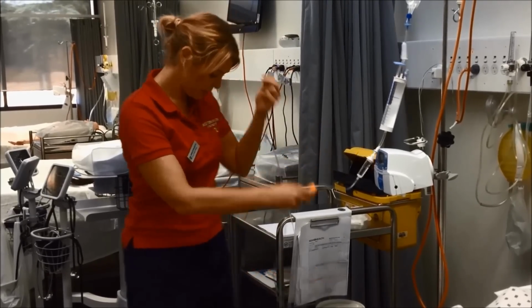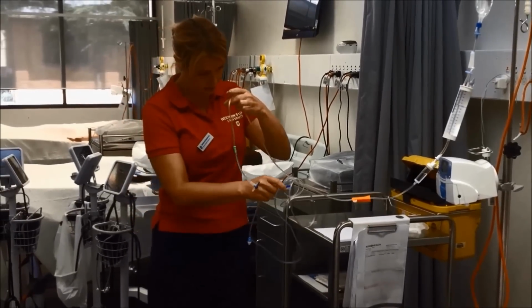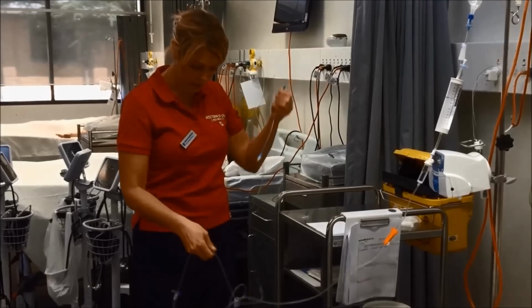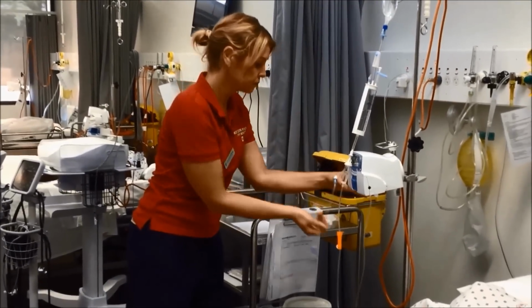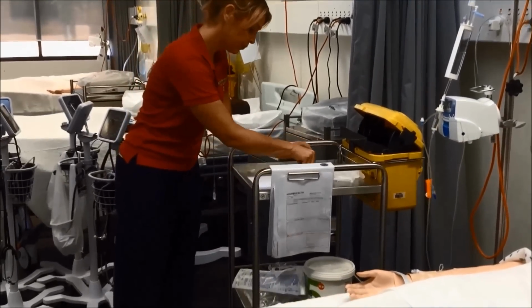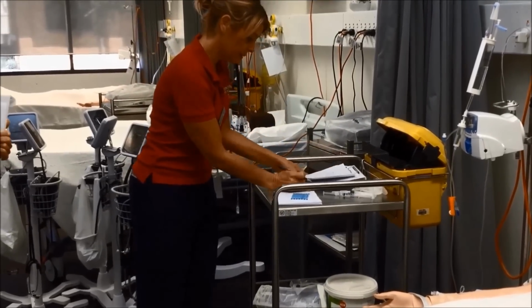Okay. My line's now primed. Oh, I've tangled it. So I'll untangle it without touching the top, so then it will still be aseptic. There we go. Put it in here. Okay, I'm just going to write my label before I put my medication in.